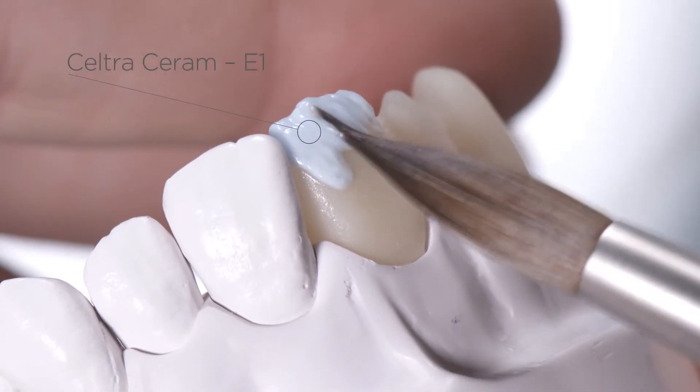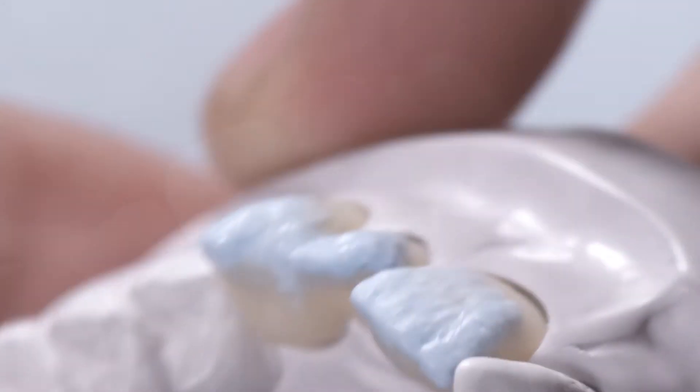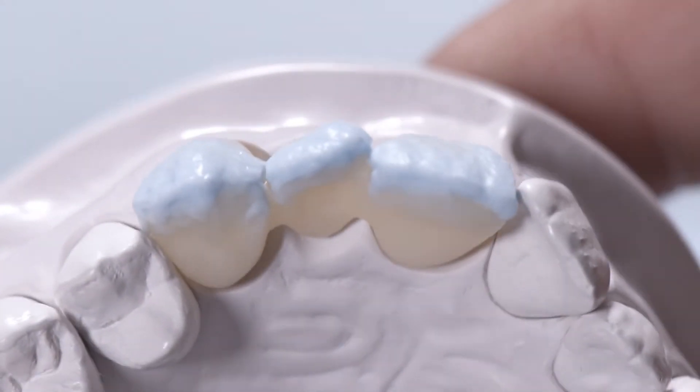Build up the labial and palatal aspects of the enamel layer with Enamel E1 and shape them to obtain their final contours.